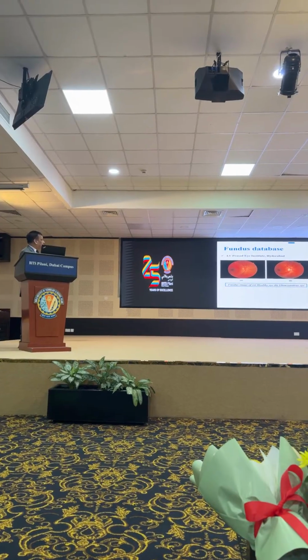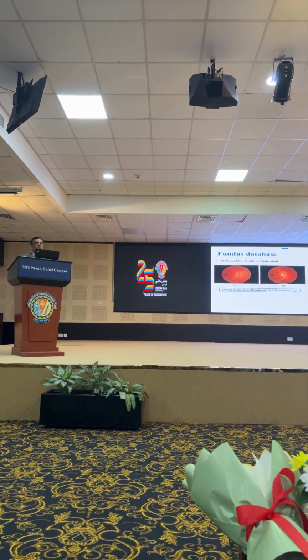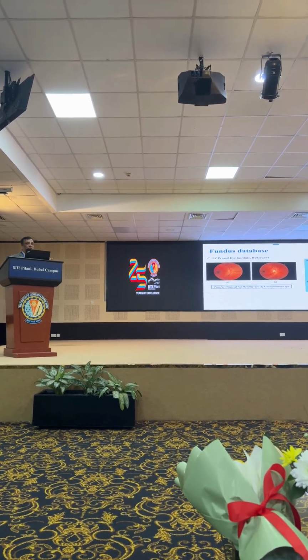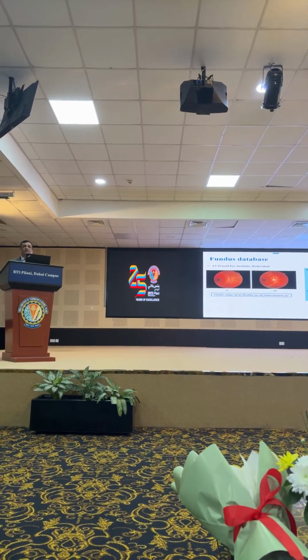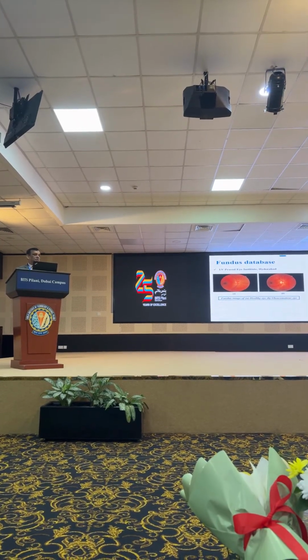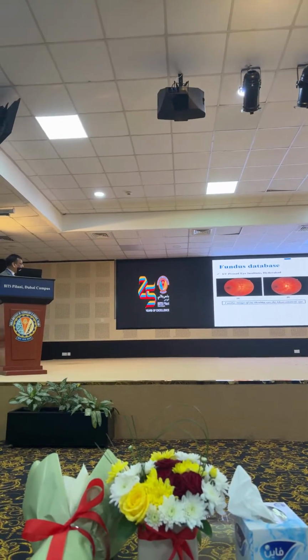So normal images are 295, and within glaucoma, they gave us 120 images: minor, moderate, and severe. We basically had to figure out, based on training and inference, what is happening to the given images. I want you to understand here, and my results later will show, that the data size, the image size, is very small. Therefore we had to do a lot of augmentation, because when you are working on deep learning, you need to have larger numbers of images so that your training accuracies will improve. That we did with the help of augmentation.